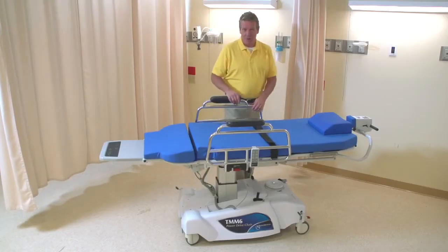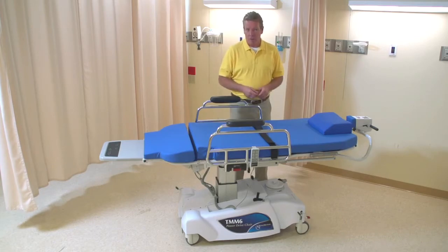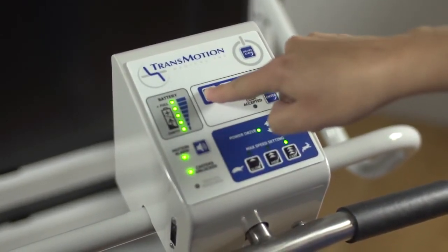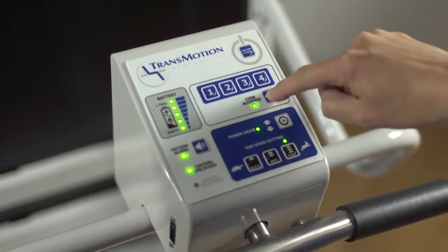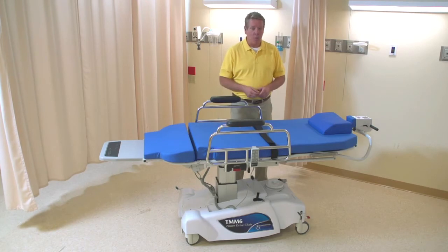Now we're ready for that test drive. Turn on the user interface by pressing the on-off clear button until the user interface lights illuminate. Enter the 4-digit security access code in the user interface. The medical facility administrator is responsible for issuing that number.